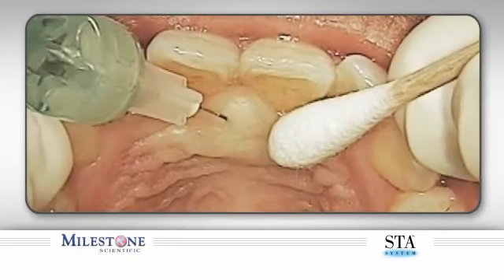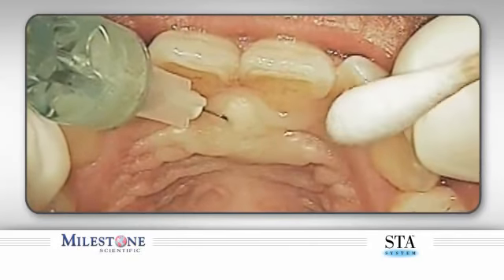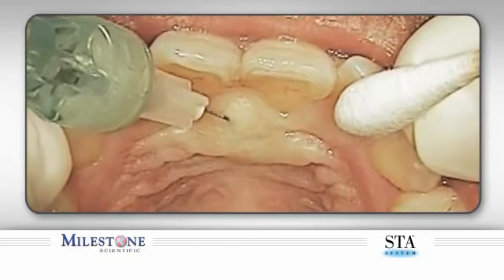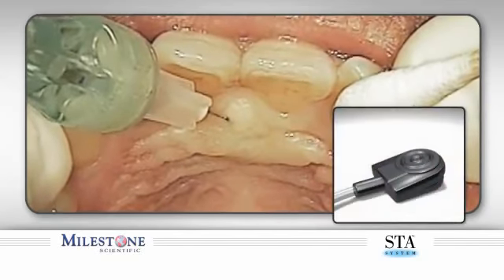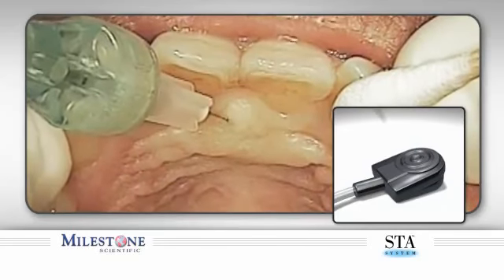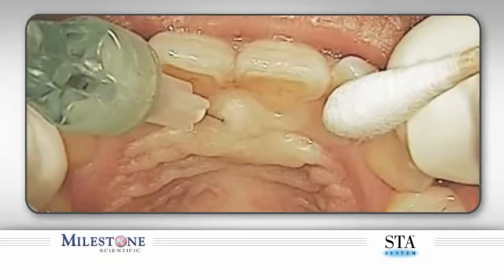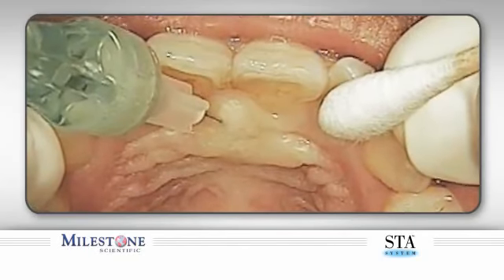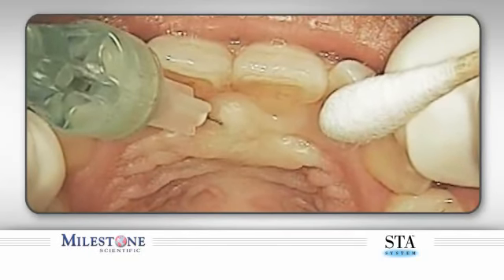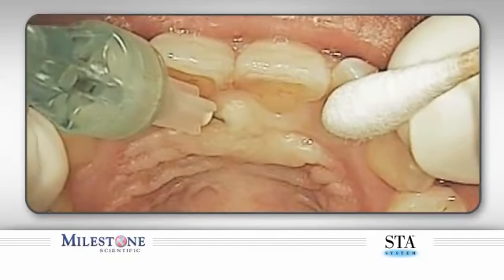Rapid movements are contraindicated. When the needle is in the canal and contacting the inner bony wall, stop movement and aspirate by depressing and releasing the foot control pedal. Do not exceed 3/4 of the needle length penetration into the canal. If aspiration is negative, maintain position and deliver the proper amount of anesthetic. As the anesthetic solution is delivered, you will notice distinct blanching of the tissue.